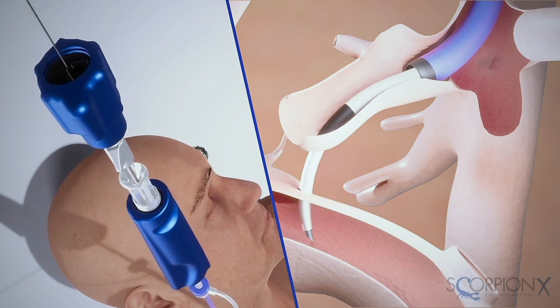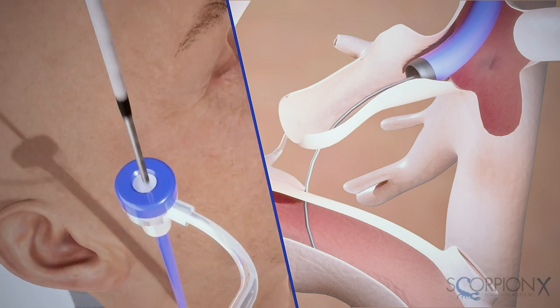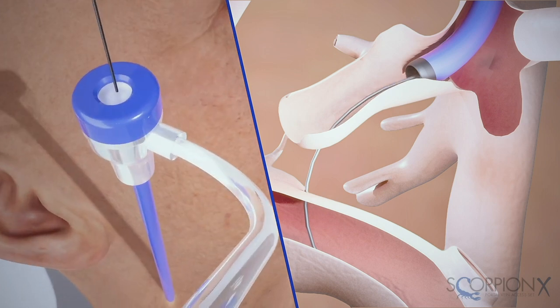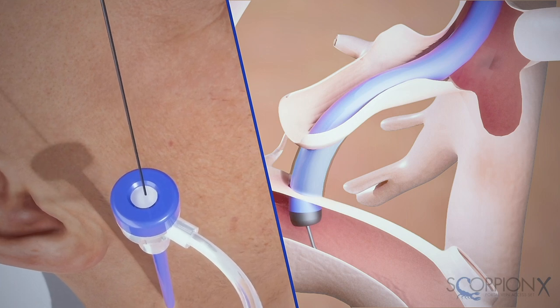Next, remove the ScorpionX assembly and leave the 10 French introducer sheath in the hepatic vein while guide wire access is in the portal vein. You can now perform tract dilation by using your preferred high pressure balloon. When dilation is complete, advance the 10 French introducer sheath from the hepatic vein through the parenchyma and into the portal vein. Perform further interventional procedures including deployment of the endoprosthesis to complete the TIPS procedure.